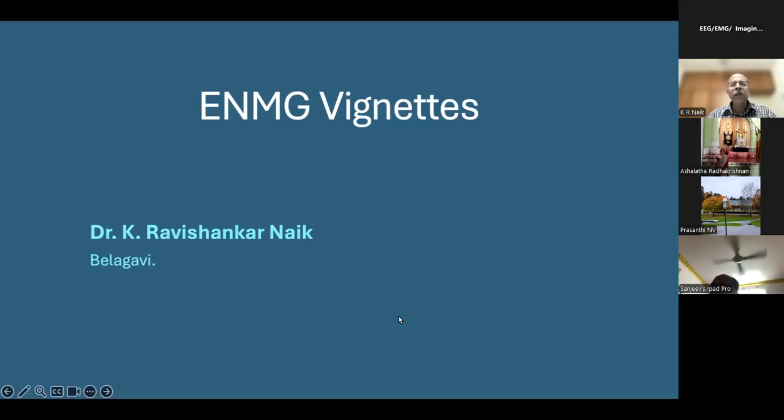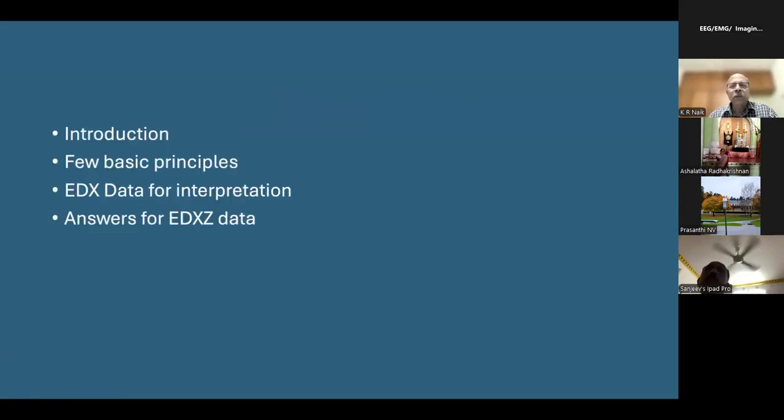So I kept the title as ENMG Vignettes. I'll start with a brief introduction before I go into the cases, and then a few basic principles I'll just highlight, then go into the data.